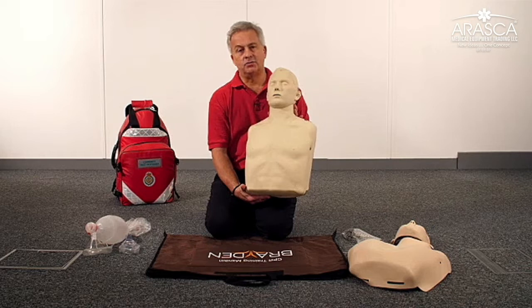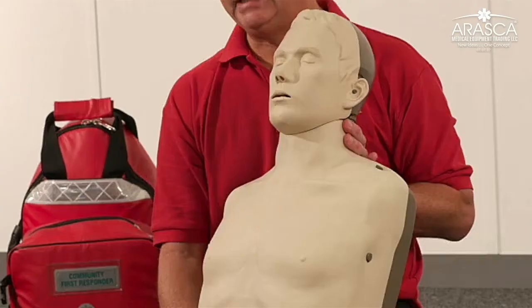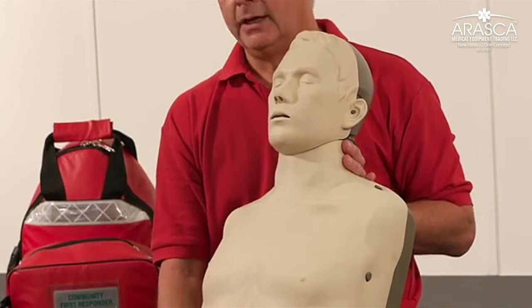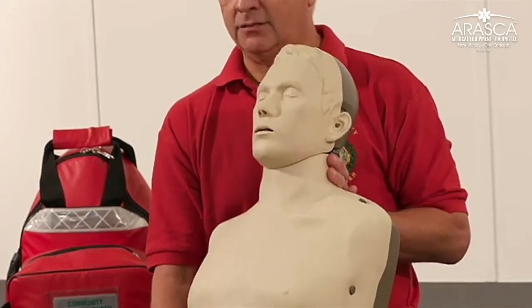We have recently introduced the Junior Conversion Kit. This allows you to convert the adult mannequin into a paediatric mannequin representing a 10 to 12 year old boy. This means you don't have to bring two mannequins to your training room — you only need to bring the Brayden and the conversion kit.